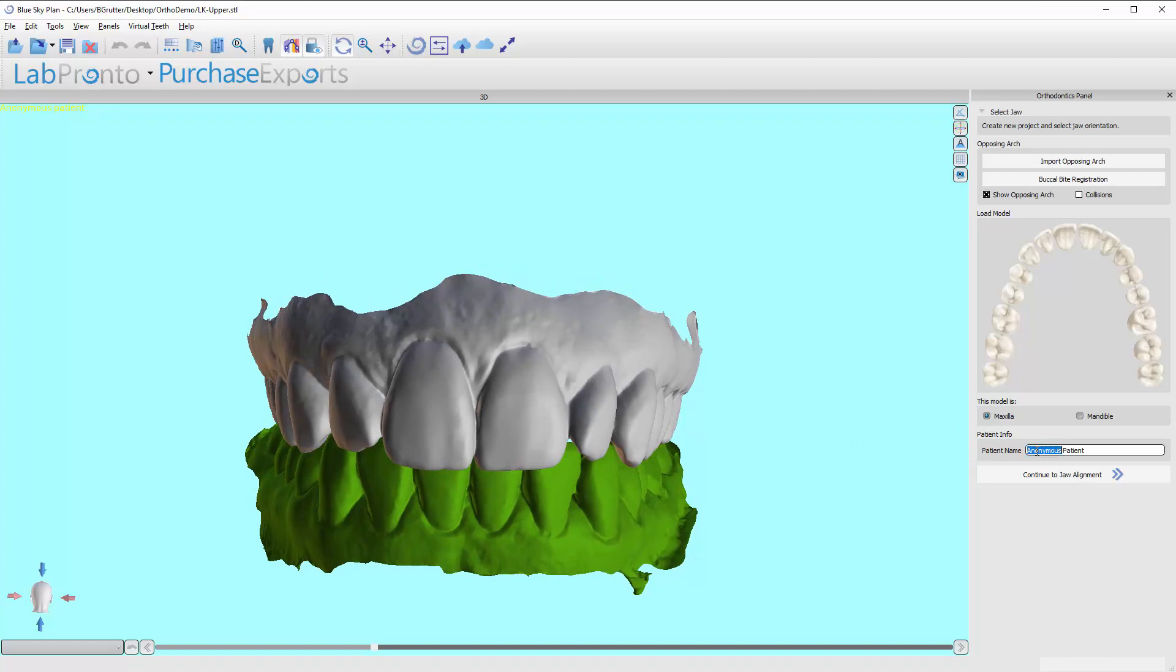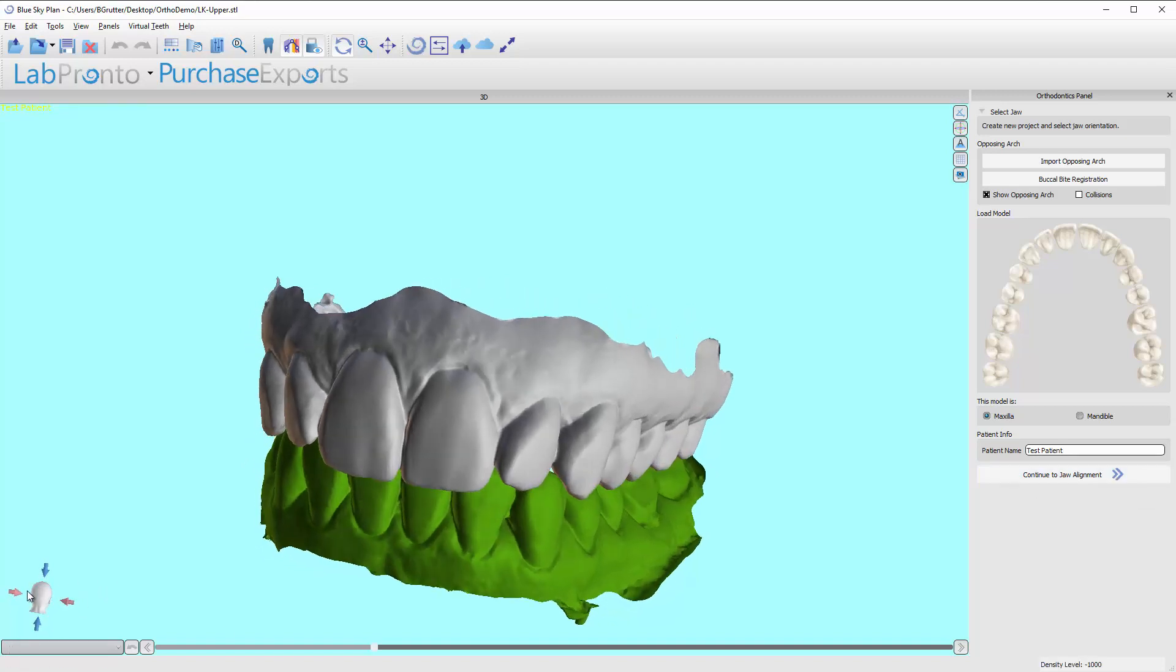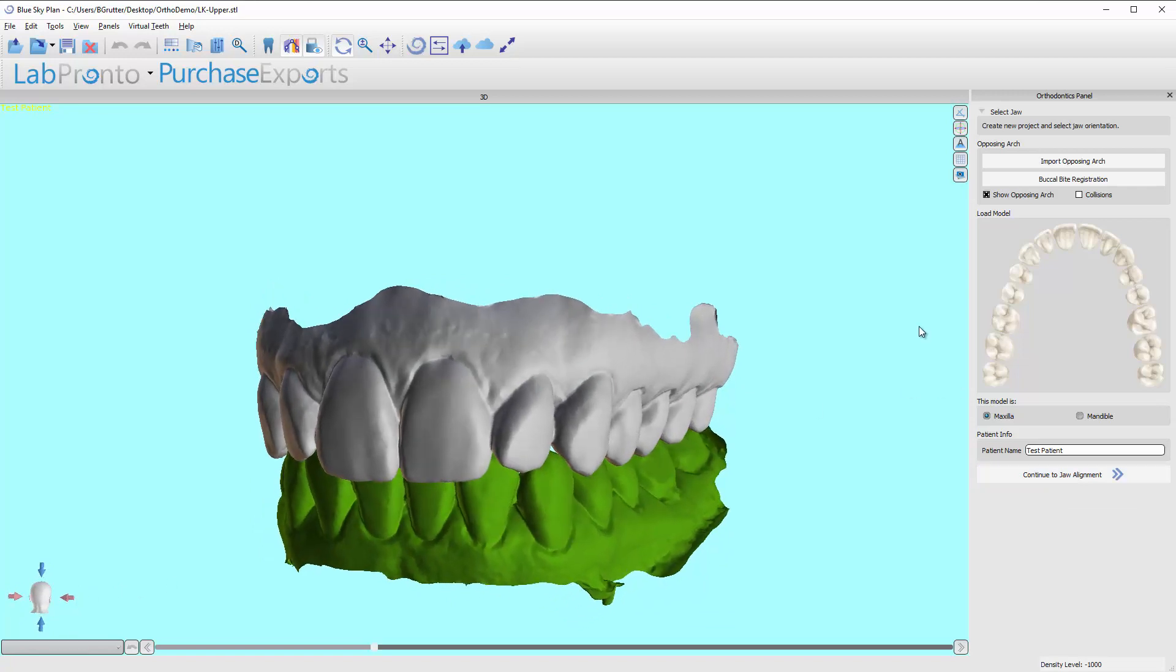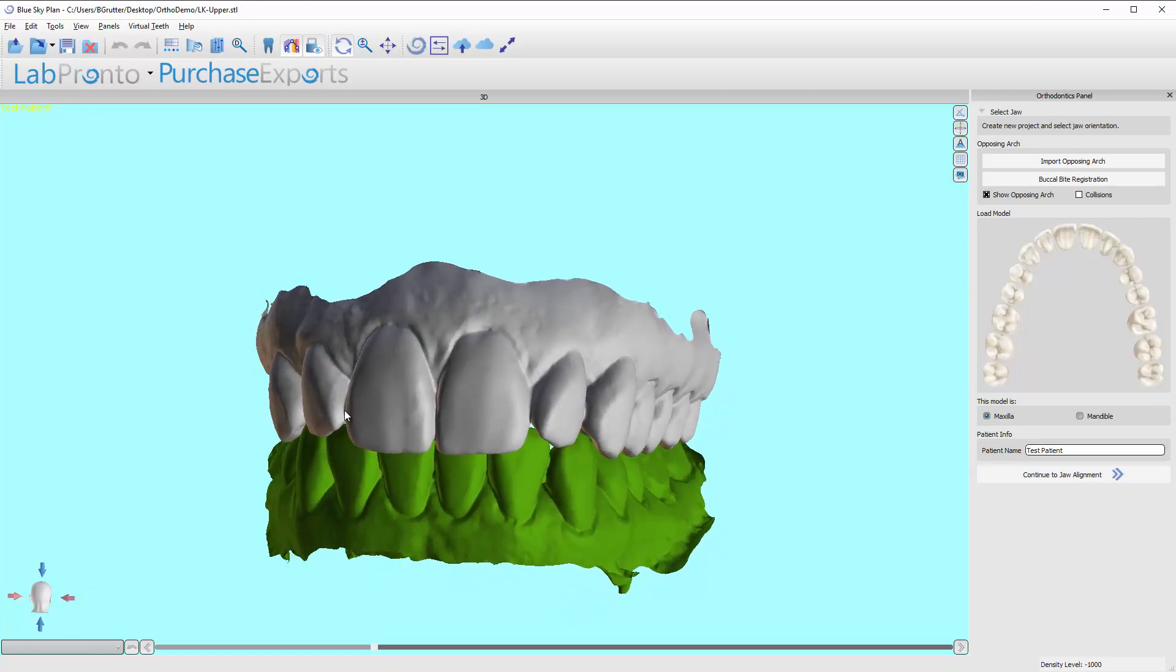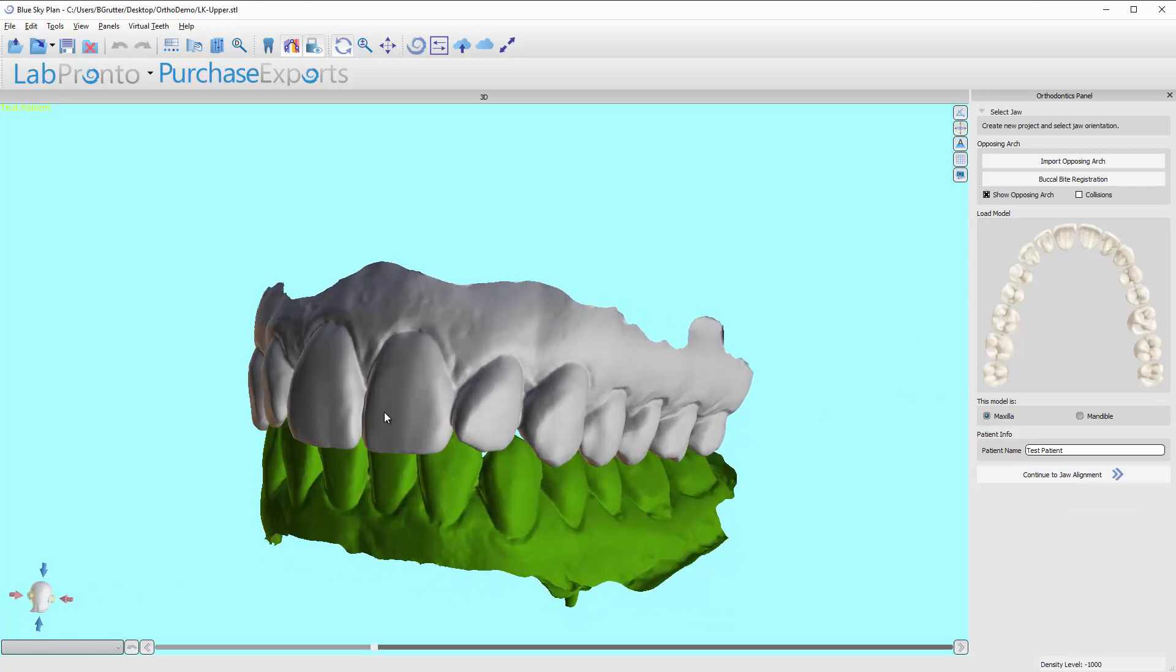Now we can go ahead and name our patient case. So I'm just going to call this test patient. And next we just need to click on this button to continue to the jaw alignment. Again, this little head down here is backwards because these models were produced in this case using the CEREC Omnicam.